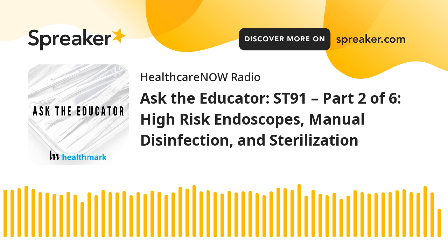We had never, in the previous version of ST91, had a classification for a different type of endoscope based on risk, but we felt it important in this one to have that designation because we are asking facilities to take different steps related to those high-risk scopes. So let's talk about what a high-risk endoscope is or what makes them designated that way.